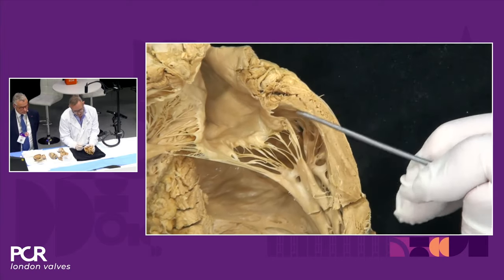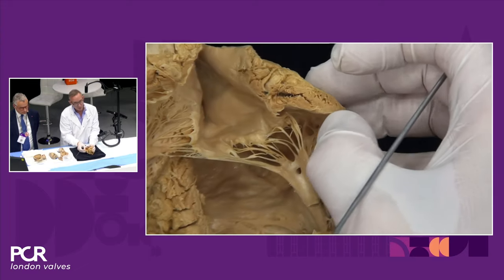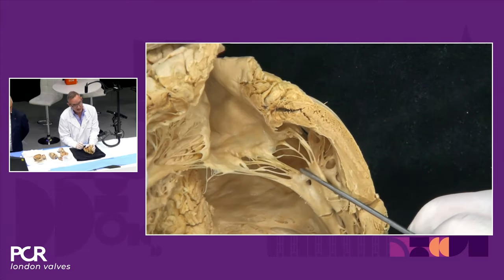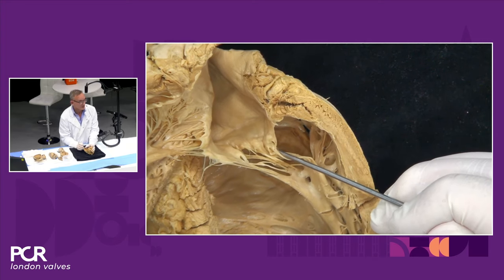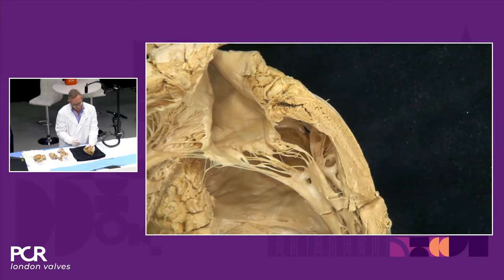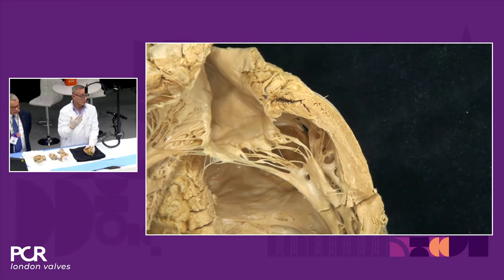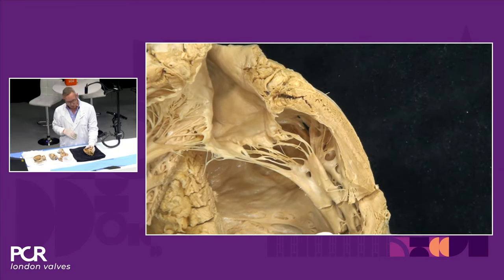So what you can see is, because this part of the wall would be immobile effectively or poorly mobile, I think you can see that on the image there, that's going to have the result of pulling the papillary muscle attachments and group towards that wall and effectively tethering the leaflet. So obviously it's a challenge to show you that in a fixed heart, but you can see even with this dissection that the posterior leaflet is being pulled in this direction. And then of course the anterior leaflet will expand to meet that, and that's what you saw with the prolapse.